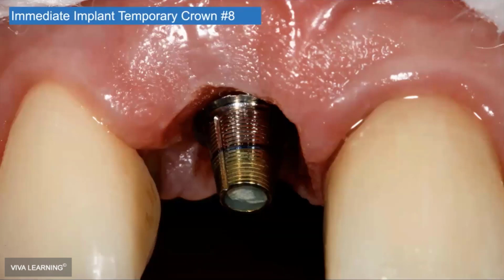And if you don't have a healing abutment to replace this abutment while you're doing all of that, it really can be a headache. It's much easier, in my opinion, just to leave it the way it is. Don't take anything out of the mouth. Just take your laser to it, expose the margins. Oftentimes, you could even scan this abutment the way it is in the mouth, and mill a crown to cement back onto that. That's especially helpful if you don't know exactly what implant system that you're trying to repair or replace.